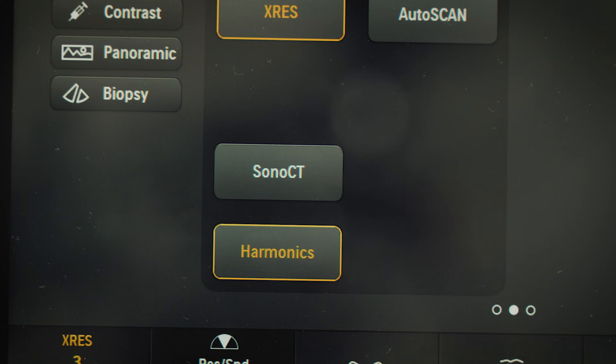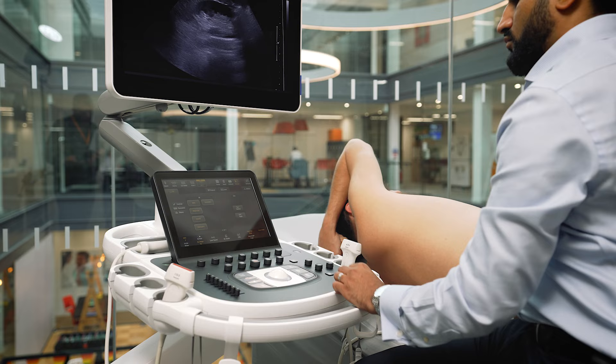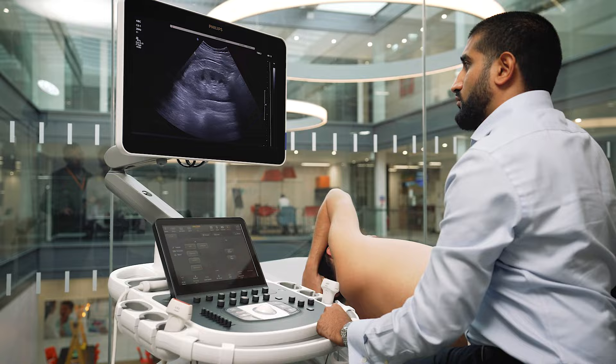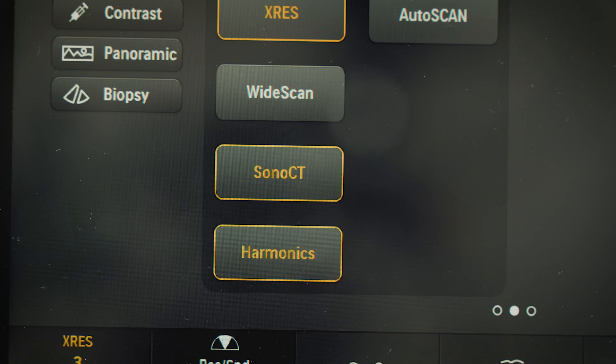SonoCT allows for compound imaging using up to nine lines of sight on the Epic Elite, resulting in fewer artifacts, less clutter, and better border definitions. The default position is on, but can be turned off with one press on the touch screen.